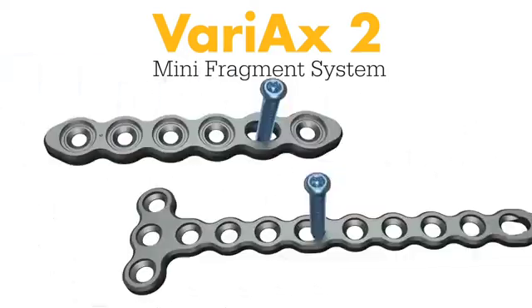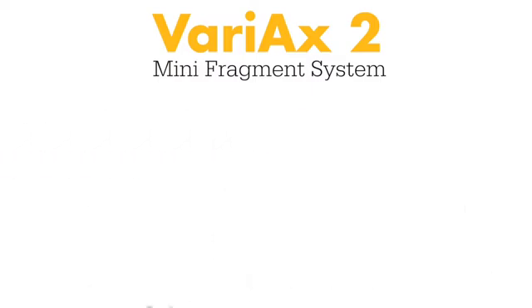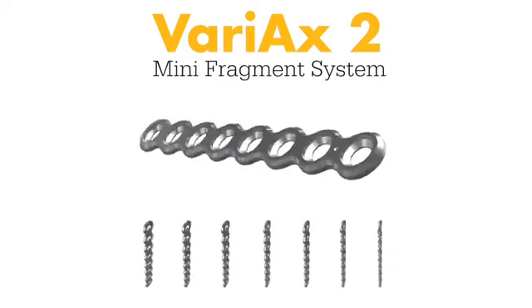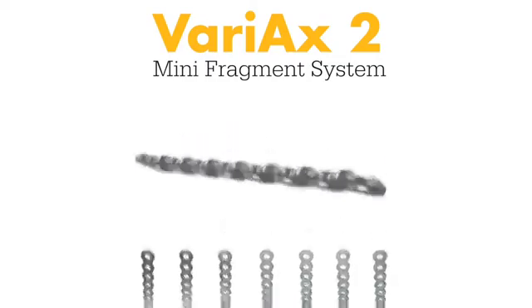These plates include oblong holes designed to offer locking or compression capabilities. In addition, the VariAX2 Mini Fragment System features profile plates, which are low-profile, non-locking plates designed to facilitate fracture reduction.